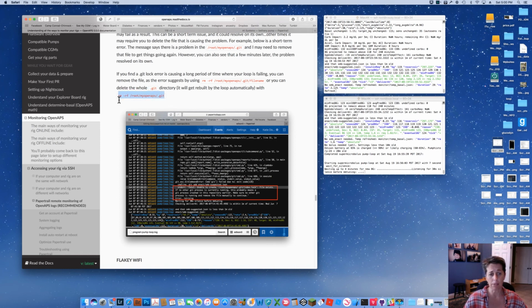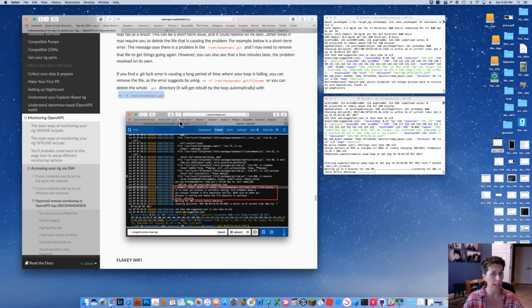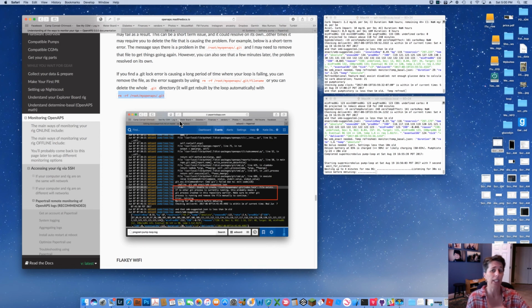You just do this line right here. That will delete the git repository, and it will automatically rebuild itself as part of the loop. So basically, it's kind of like a file got corrupted, it can't get overwritten, it locks up. So by clearing out that locked up file, you'll be able to start looping again.